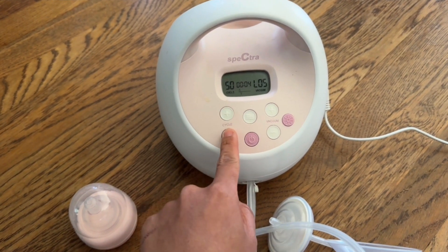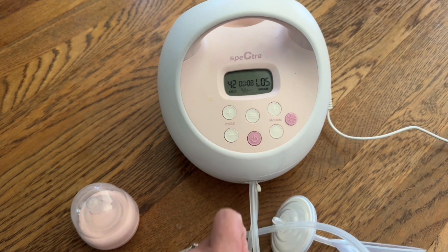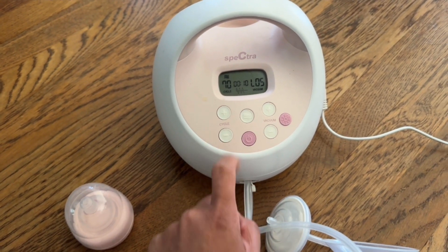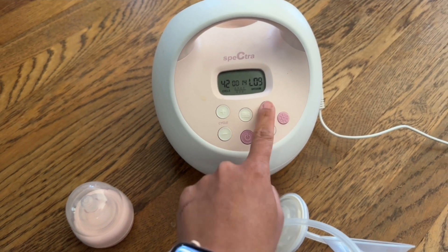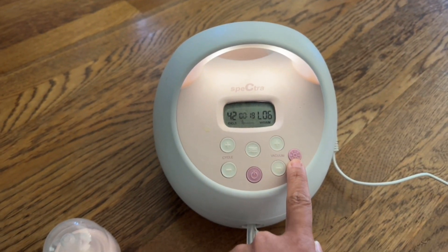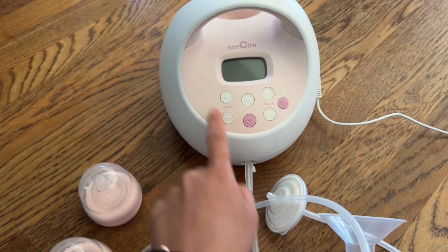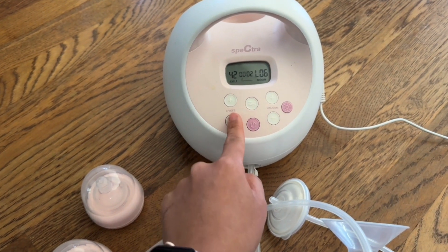The system has different settings — you can press all these different ones. The vacuum you can increase or lower. This right here is also a light if you're pumping at night. There are a lot of different settings that you can do.